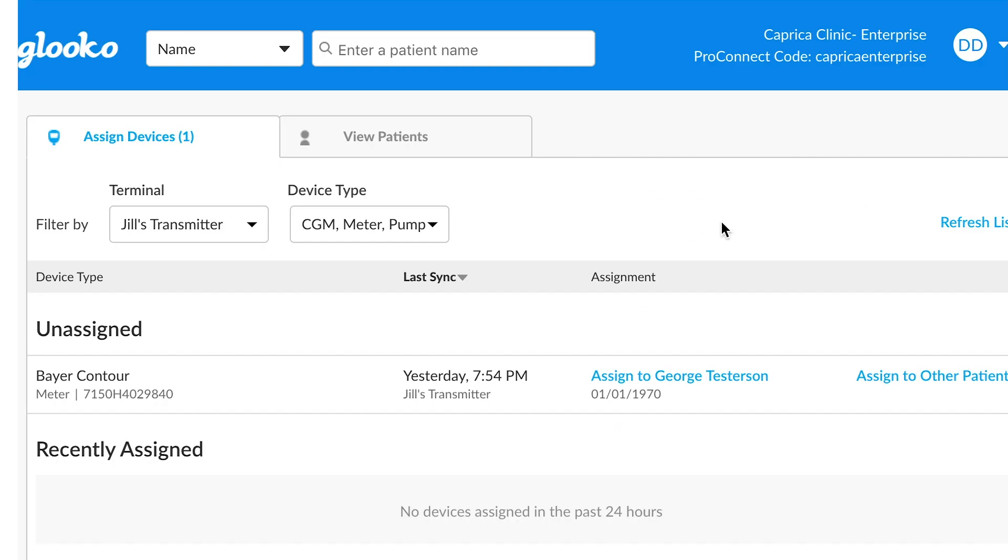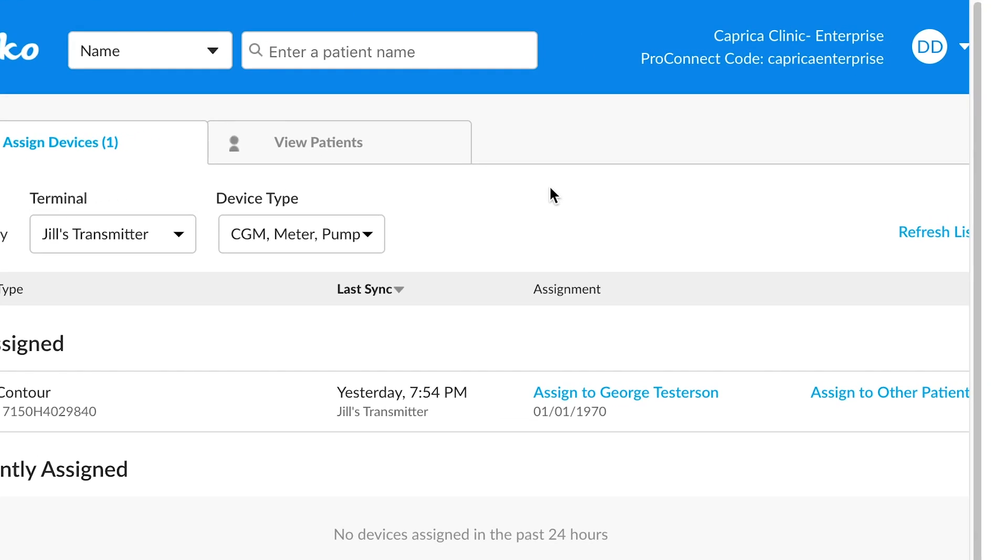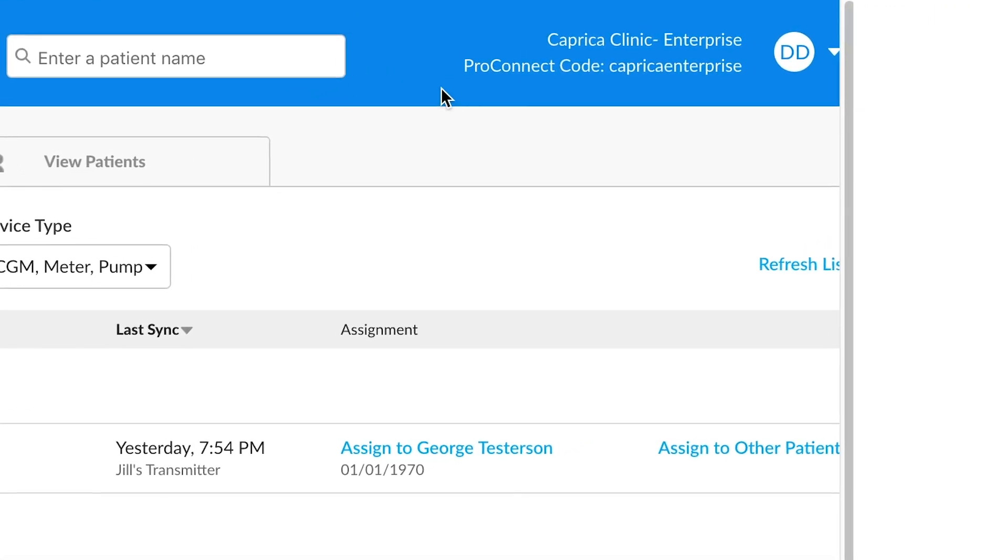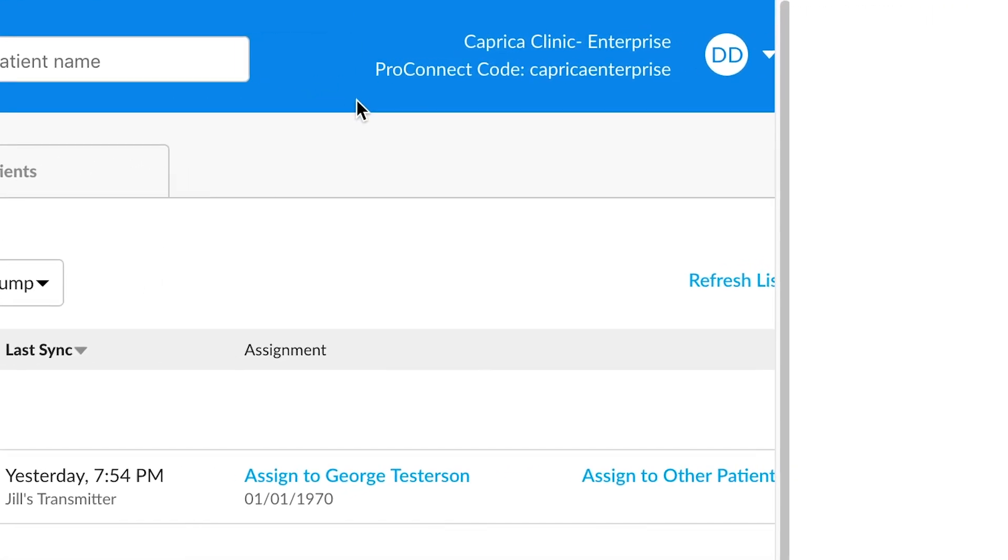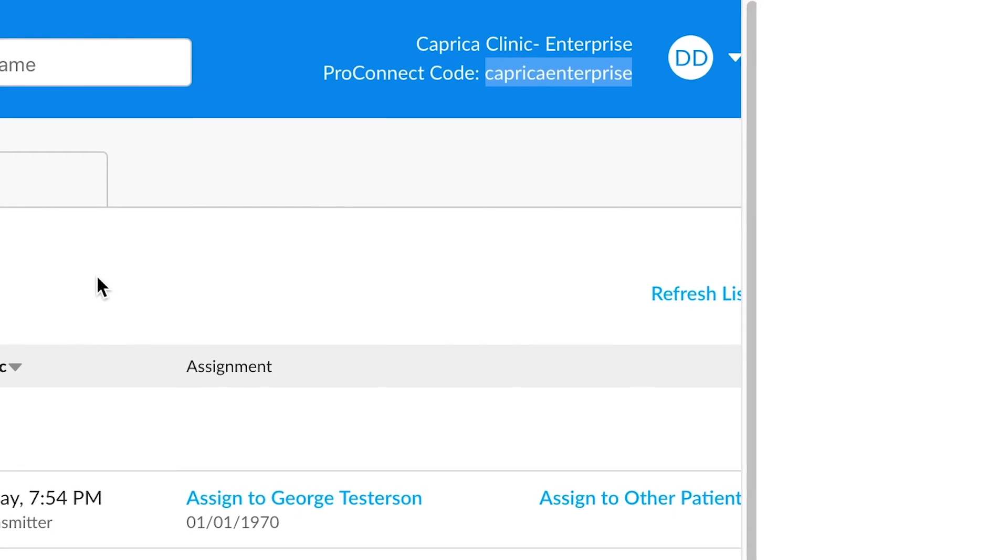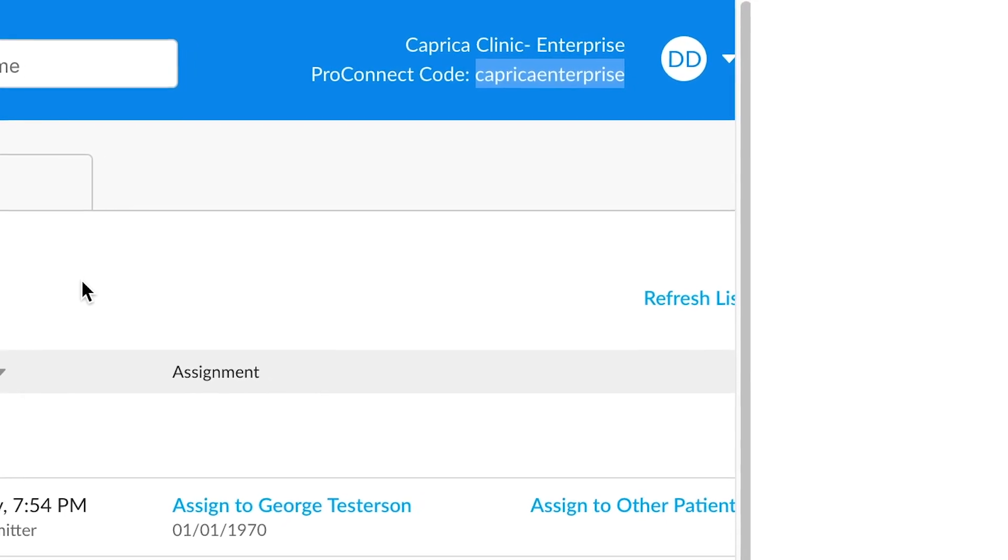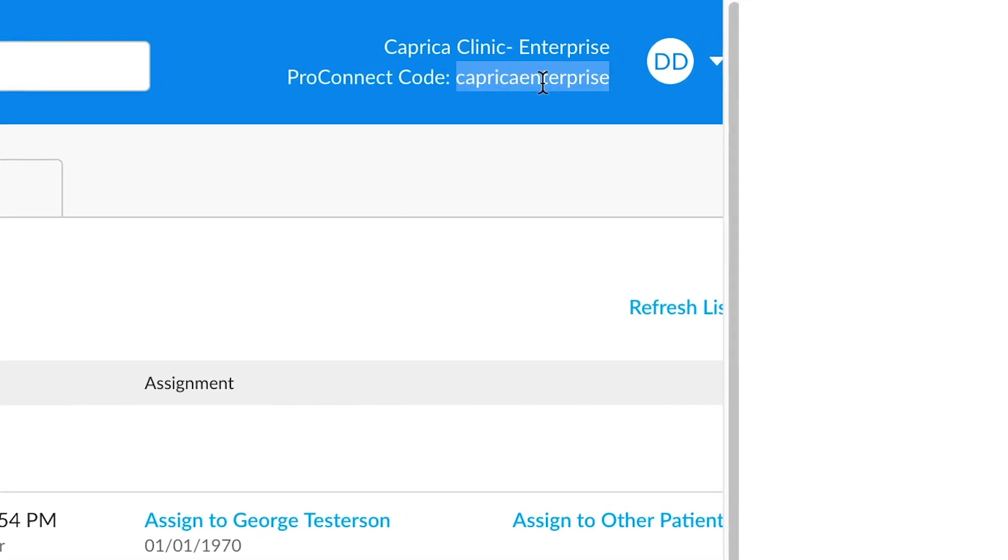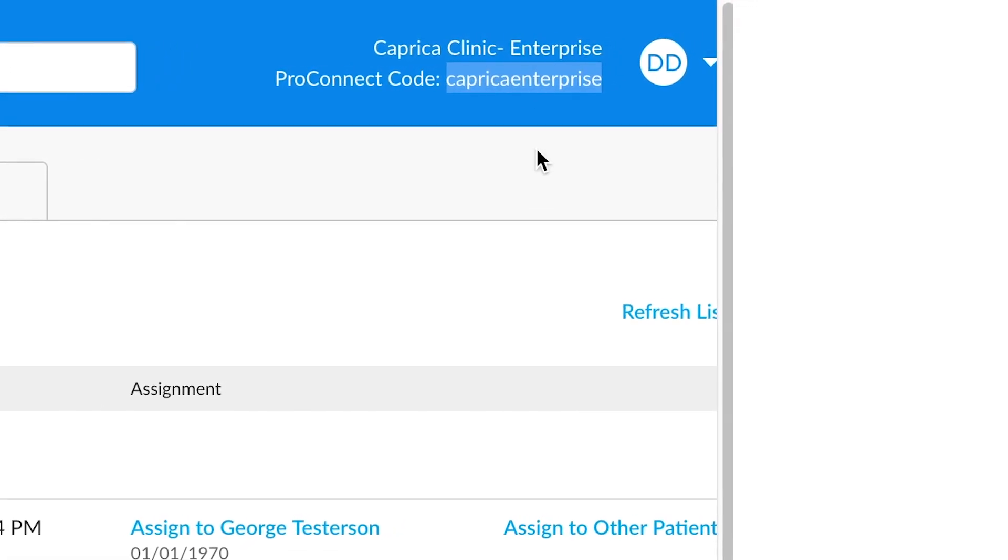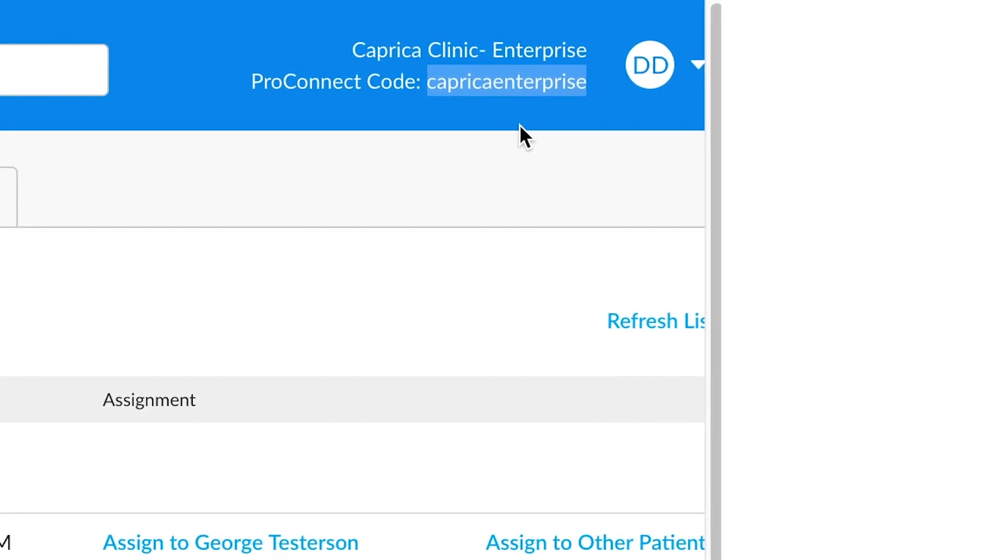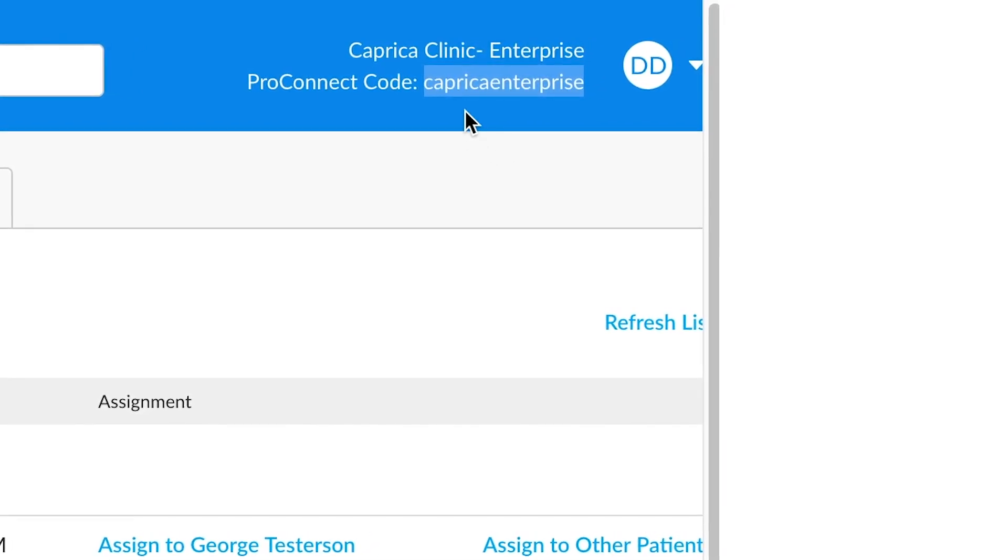And then once you're done with that, you'll want to click the sign-in option here. All right, great job. You have now signed into gluco and you'll see there's a bunch of things available here. One of the most important things is the gluco pro connect code. That's the code that connects a patient account to your provider account. It's generally all lowercase, all one word. There are some exceptions to that, but if you just give them this small code here, a patient can connect to your provider account.